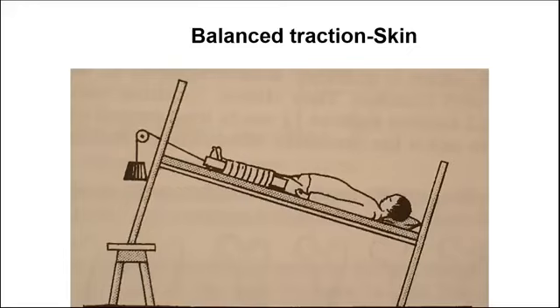Otherwise, the blocks, again, you can standardize them. So that is how you can come up with your system that can help you to use balanced skin traction as a technique for non-operative fracture treatment in your respective practices.